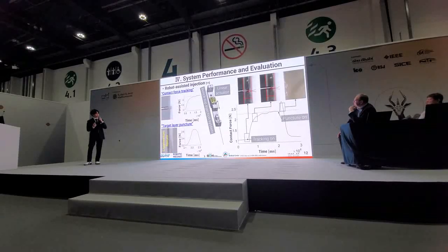According to the result, in the tracking mode, the epidural injection system maintains a contact force with the ligamentum flavum, and in puncture mode, we can observe a sudden drop in the contact force due to the ligamentum flavum puncture.